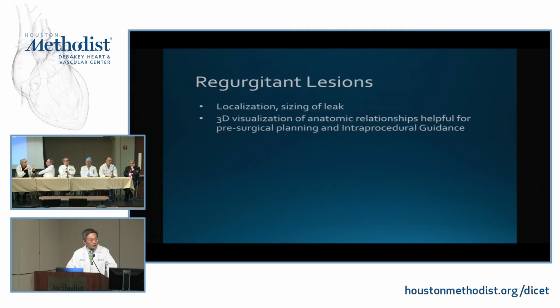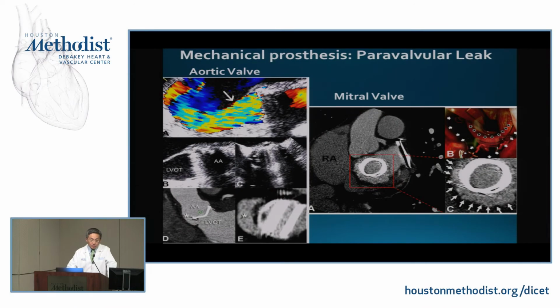I just want to make one other statement about that. FDG PET, I think, is going to be extremely helpful in terms of looking at these issues because you can actually characterize between inflammation, which may be present, and infection based on the intensity of the FDG uptake. So that's also an area that's growing in terms of being able to look categorically at these kinds of issues.